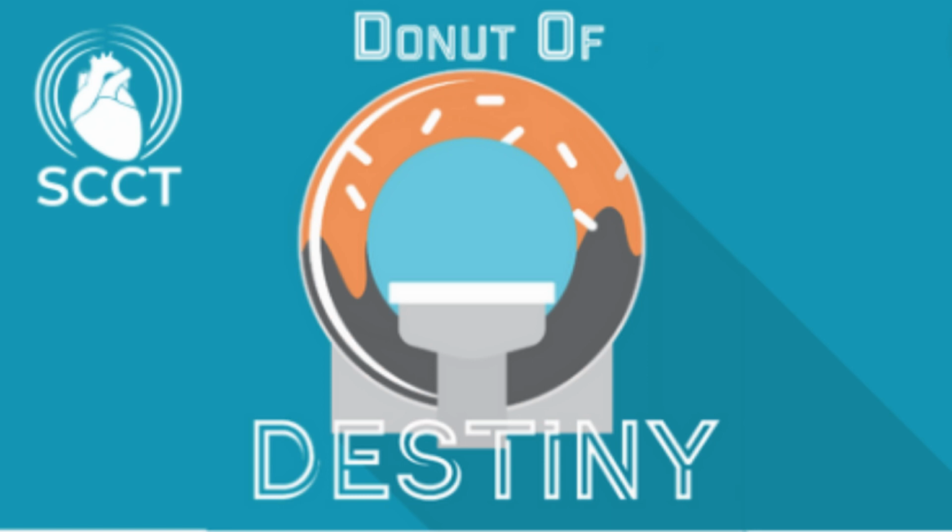Yeah, so I think we briefly touched upon a very slow heart rate. Your RCA and circumflex can be somewhat blurred if there is a very low heart rate, because you never extended your acquisition into the isovolumetric relaxation. That is one. Second, with this technology we are not using beta blockers, so if someone happens to have a very high heart rate, that can be a challenge.